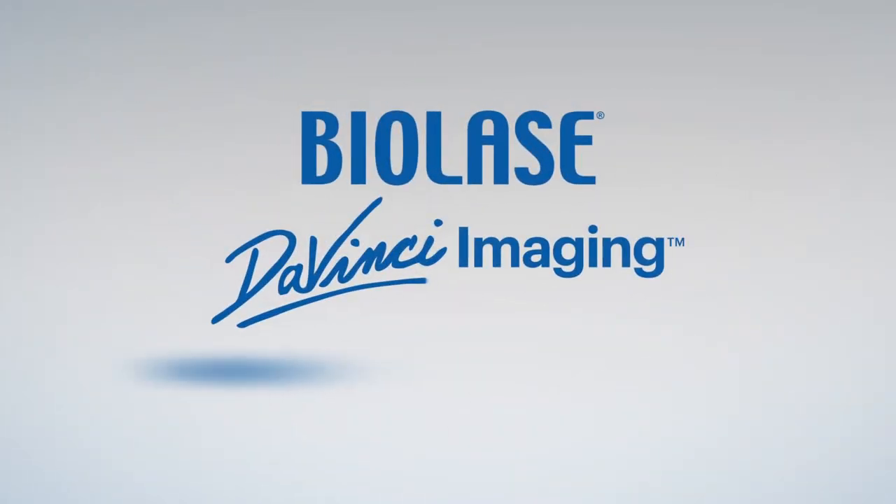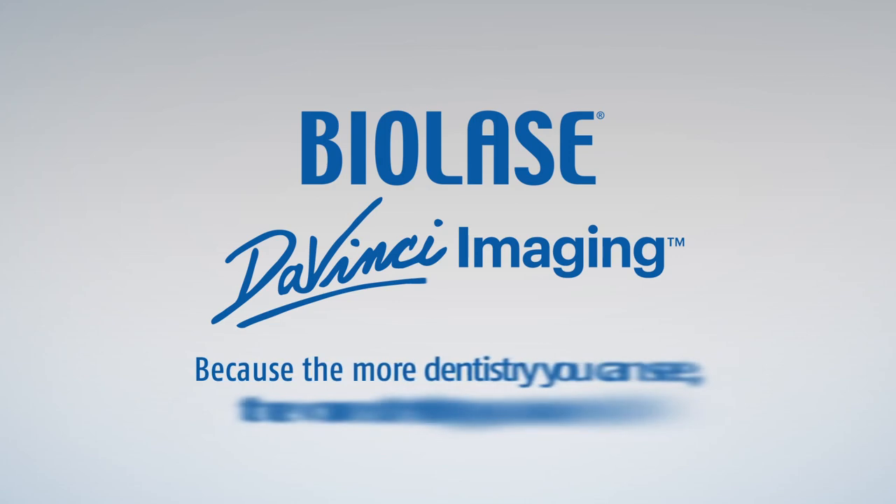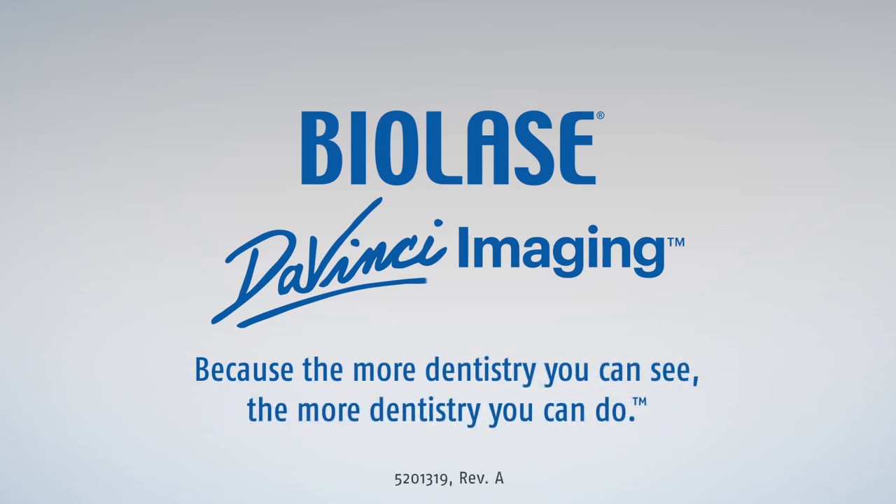BioLase DaVinci Imaging. Because the more dentistry you can see, the more dentistry you can do.